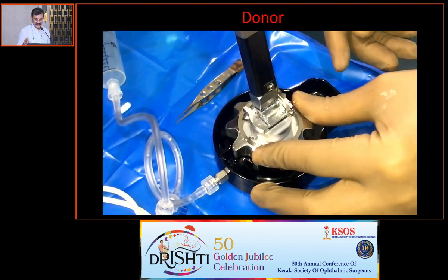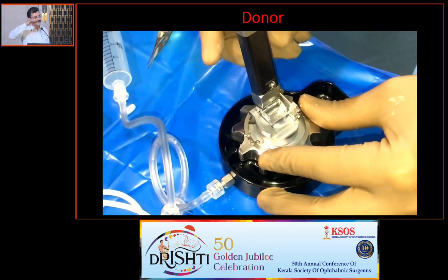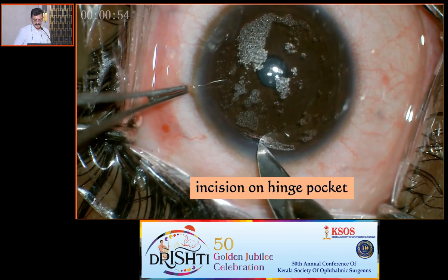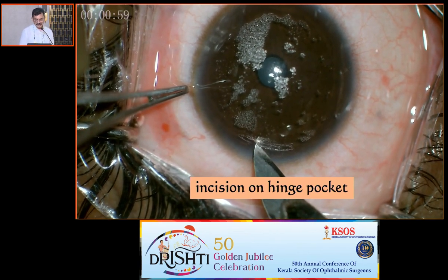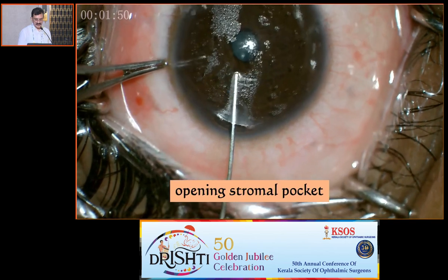And this is the microkeratome-based one. I feel for deeper cuts, microkeratome is better than femto. Femto gives a little bit of irregularity. So with the microkeratome, I cut the lenticule, and the pocket, this particular one we did with the femto, around 200 microns thickness pocket. Then open the pocket, and it comes out very nicely. The pocket is not a big issue.